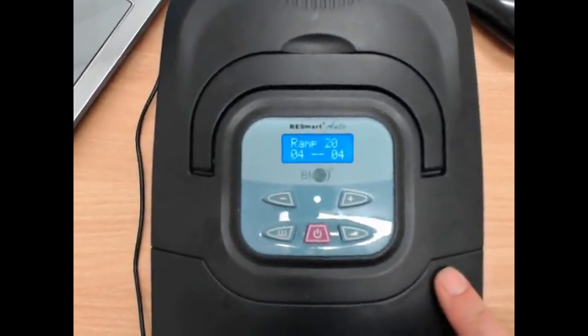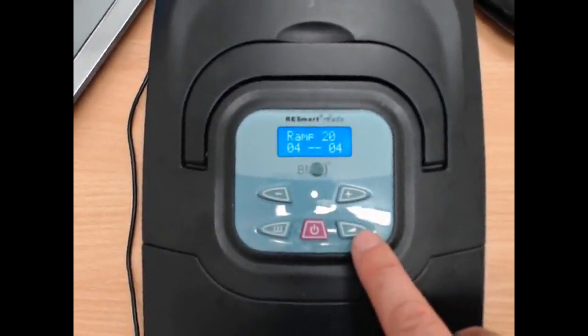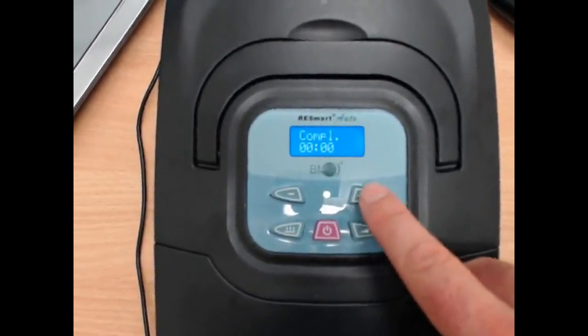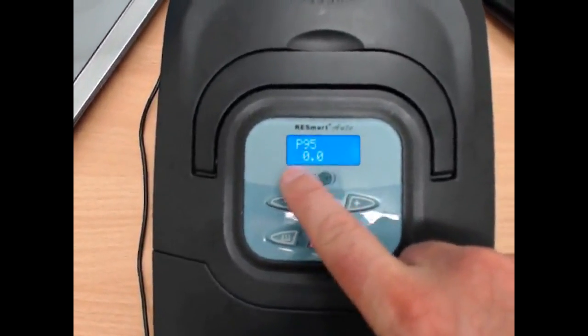There's some other things we can do with this machine. If we click this button up the top here, this one, just don't press and hold it, just click it. We can then press the plus button and we can go through and check out what's called the P95.